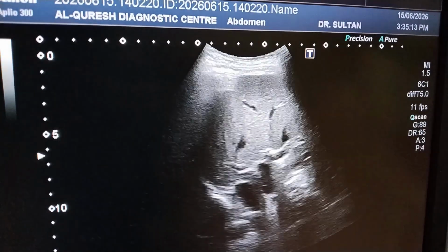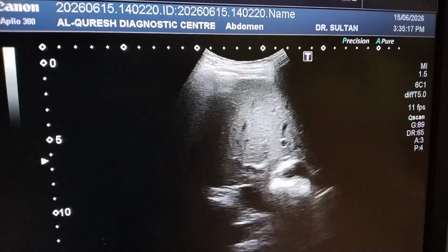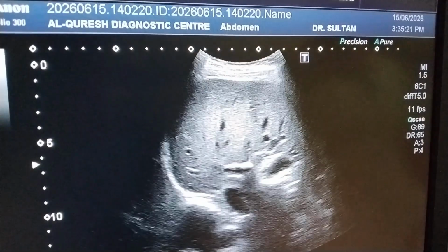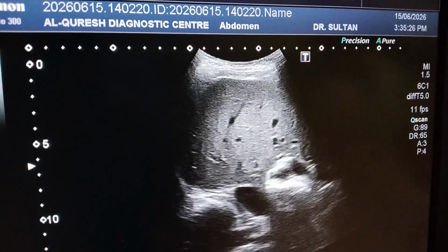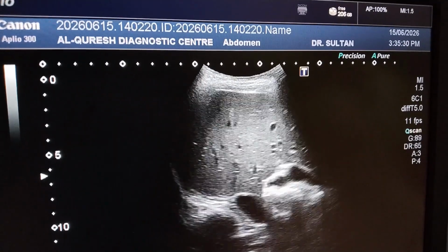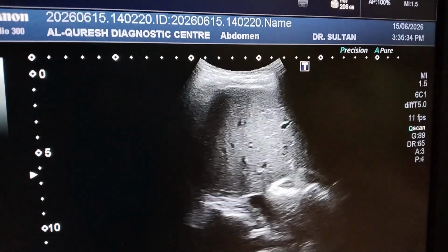Dear colleagues, I am Dr. Sultan Ayub, working as a radiologist. This is a male 16-year-old patient with history of bilateral mild pain in the flank region, renal area.